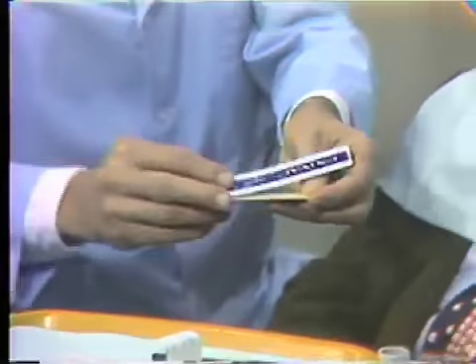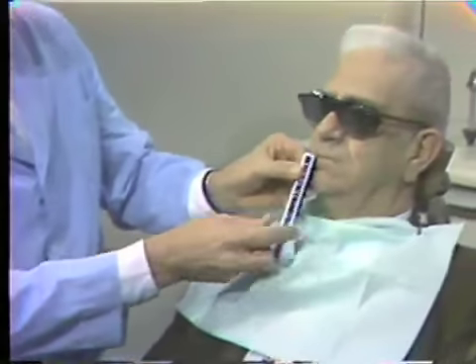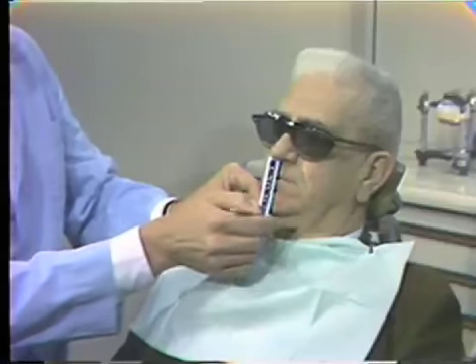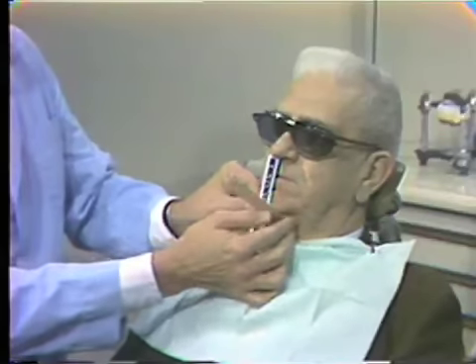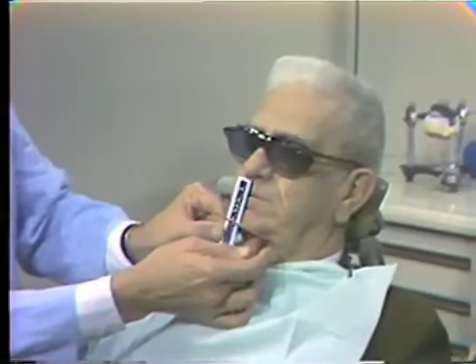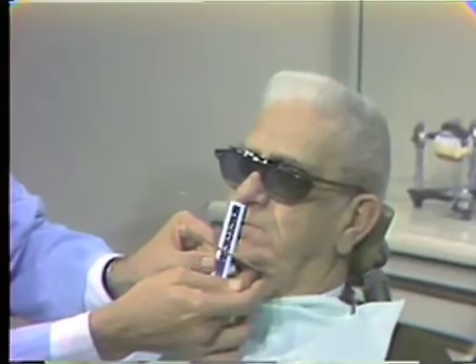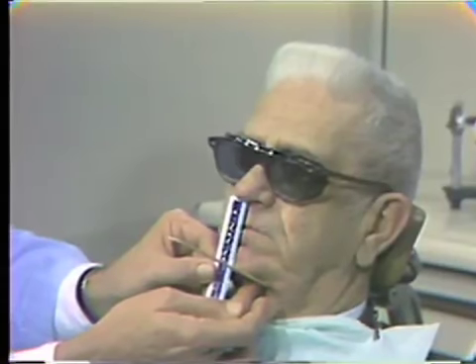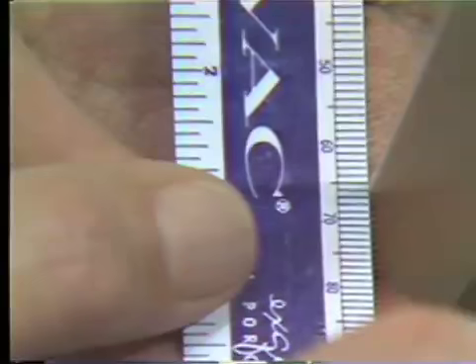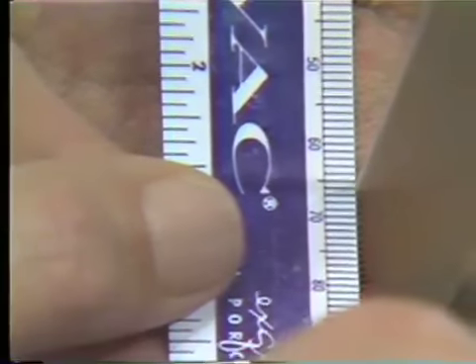We will place the millimeter rule firmly against the base of the patient's nose, place the tongue blade under the chin, and hold it securely under the chin with one finger. We now then can reproduce this measurement. As you see here, it is about 66 millimeters. This is his vertical dimension of occlusion with his teeth closed.